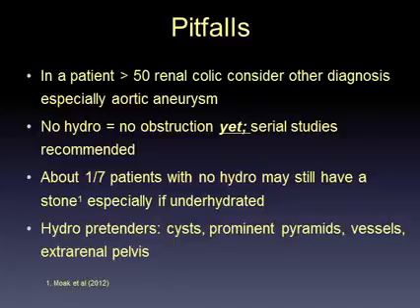When you see no hydro, that just means there's no obstruction evident when you do the scan. We encourage you to do serial studies while the patient's in the ED, preferably after a bit of hydration. Even so, about 1 in 7 patients, or around 15%, that have no hydro evident, may still have a stone, especially if they haven't been adequately hydrated. So bear that in mind when formulating your differentials.